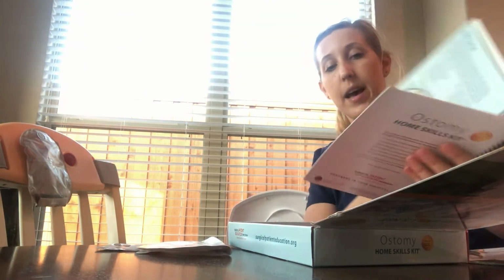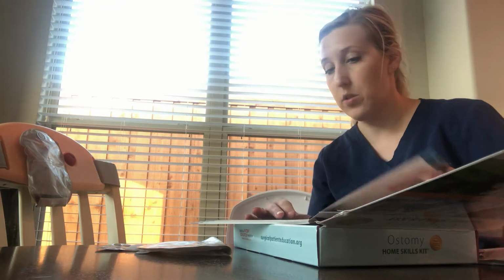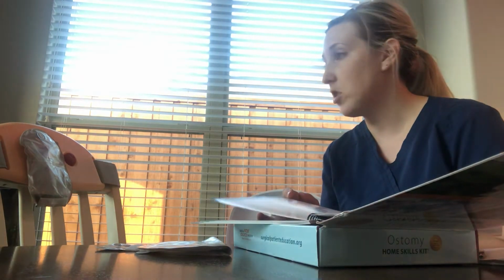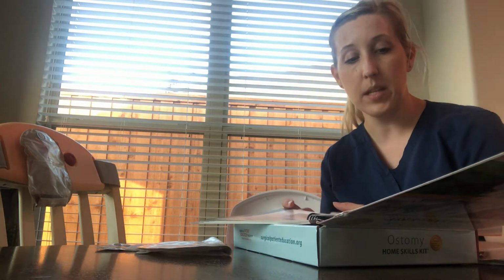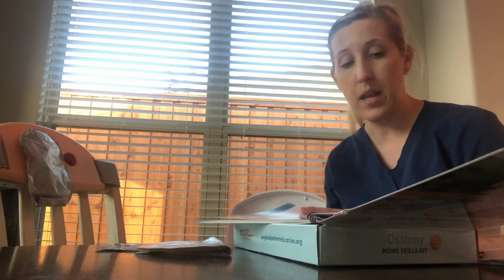We also have in our kit an ostomy skill guidebook. It has a DVD in it that talks about welcoming. It also has what a colostomy or ileostomy is. It talks you through that. Understanding your digestive system. It talks about, much like yours with the ileostomy, that it's an opening created by the surgeon to bring the small intestines to the surface of the abdomen. An ileostomy can be temporary or, in your case, permanent.